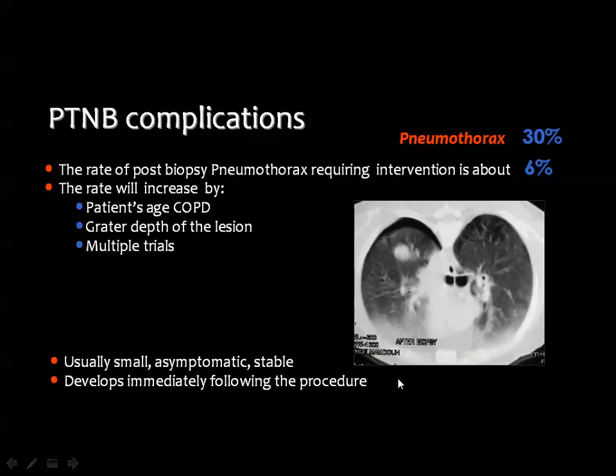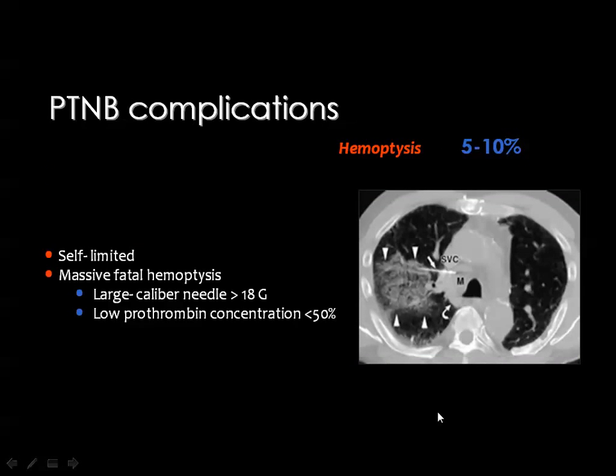And many times, as many as 30% of the cases may develop a small amount of pneumothorax after the procedure, and this pneumothorax is self-limited and it resolves spontaneously. But about 6% of the cases may develop pneumothorax that is rapidly accumulating and needs some intervention.